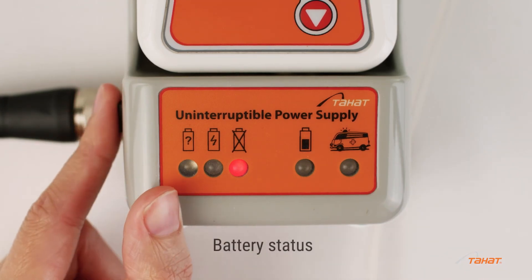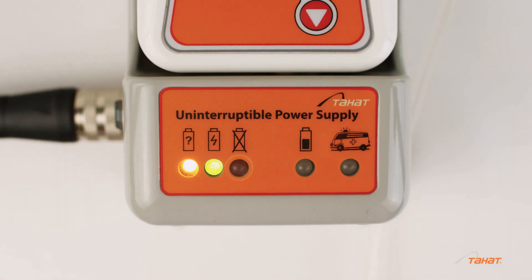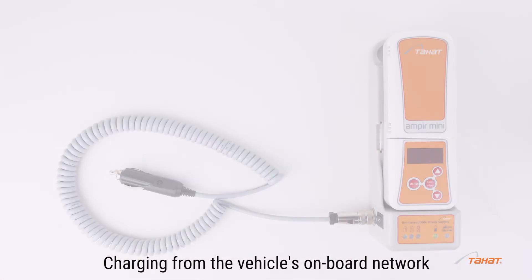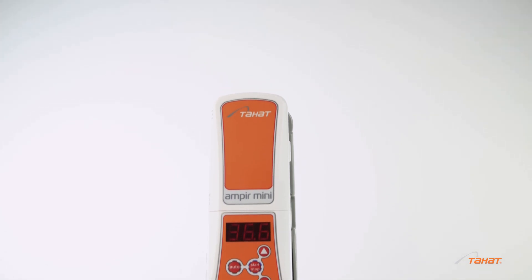A battery status red indicator means the battery unit is faulty or disconnected — switch it to position 1. A yellow indicator means the battery is connected and under analysis. A green indicator means the battery is charging. It is also possible to charge from the vehicle's onboard network. More information can be found in the user manual.